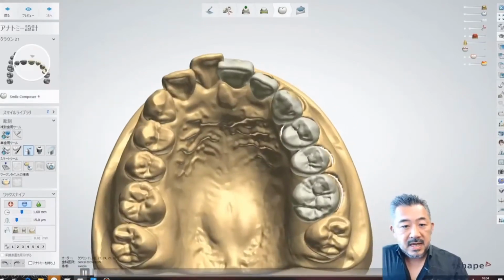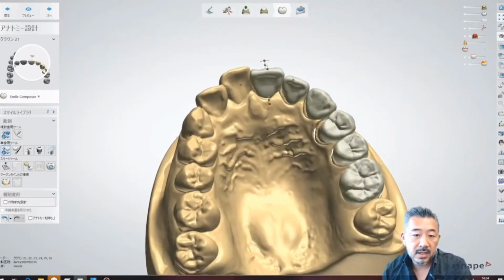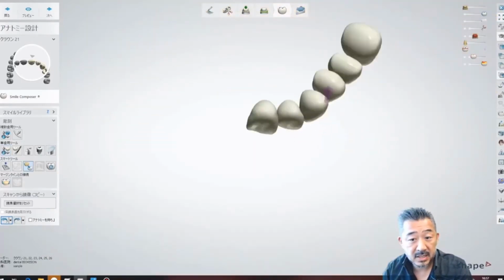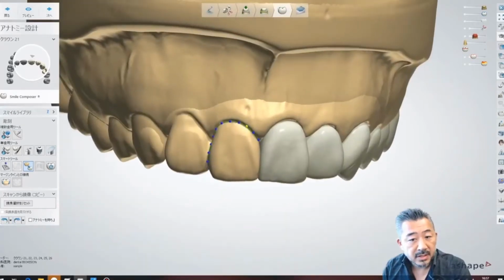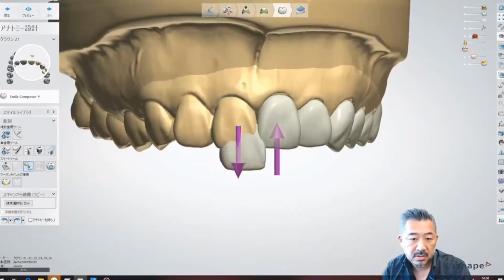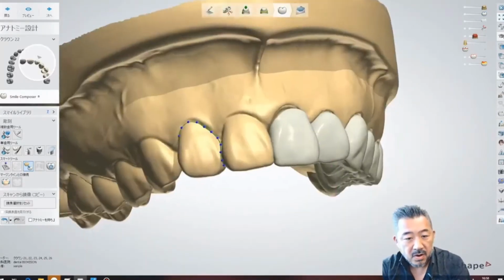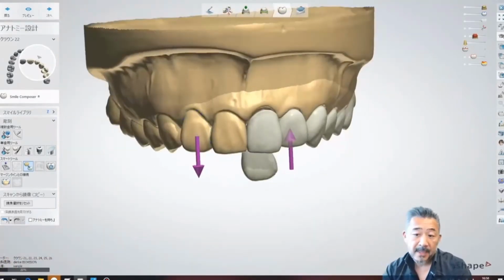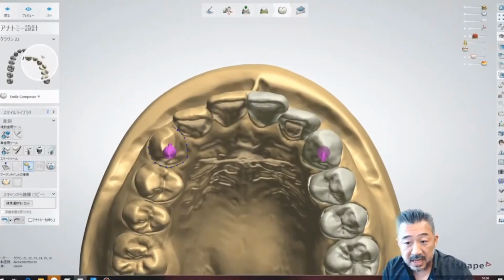For the design, use the group transformation tool to move all crowns when the crown of the opposite side is helpful. Each shape is displayed in reverse if you use a mirroring tool. The rectangle arrow is displayed now. Then select the part you want to transform. This video is at double speed to save time. I'll mirror all the crowns from 21 to 25, except 26. As you can see, this tool makes it easy to get symmetry, right?